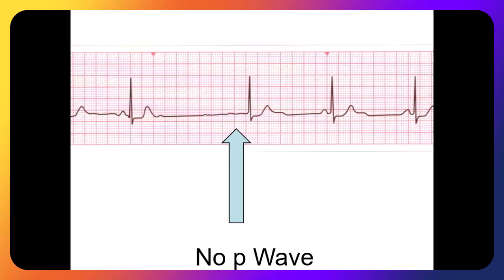We've got kind of a plateau over here on this one. Now we do see it over here on this one as well. So it may or may not be. That's why I'm not willing to bet the house on saying that's the T wave and a P wave combined together. But in that situation, we definitely do not see any kind of a P wave. No P wave, no PR interval.